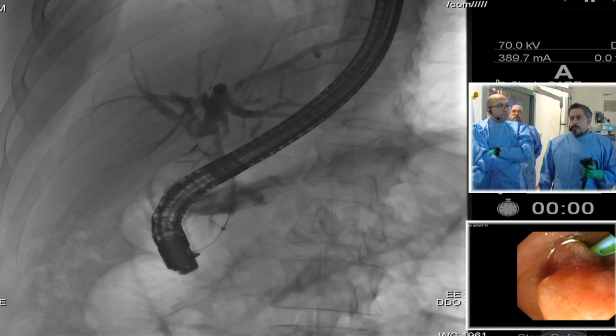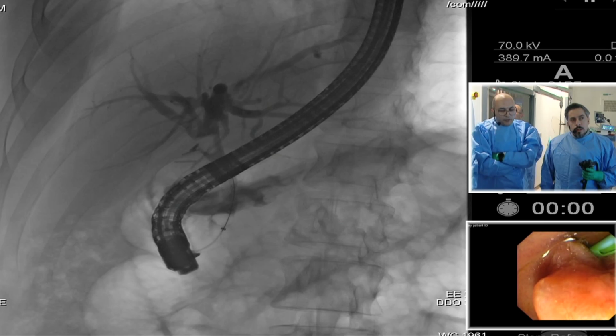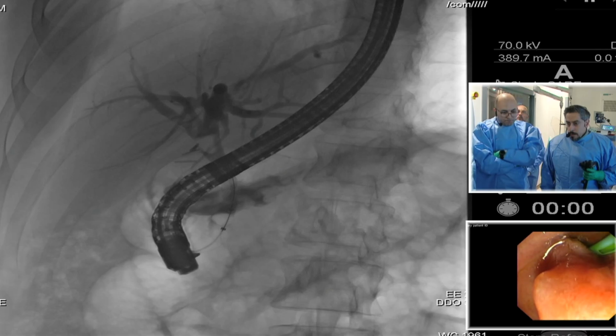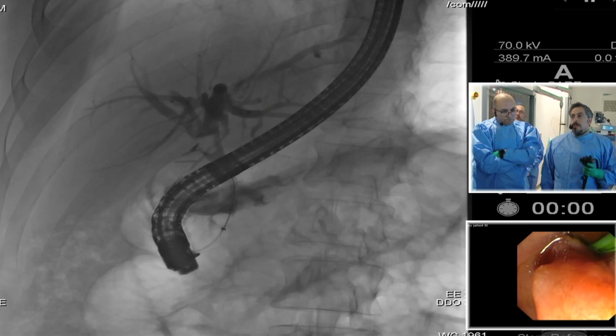Any more questions? Yes, there is one small comment. Thank you very much for the great demonstration. Just as Dr. Hamad was saying, apparently the patient does have a stricture, but it's not very clear on cholangiogram. The cholangios are good; they're not perfect by any means. But my understanding, this patient is young and had multiple interventions, so it's probably a benign stricture from stones.